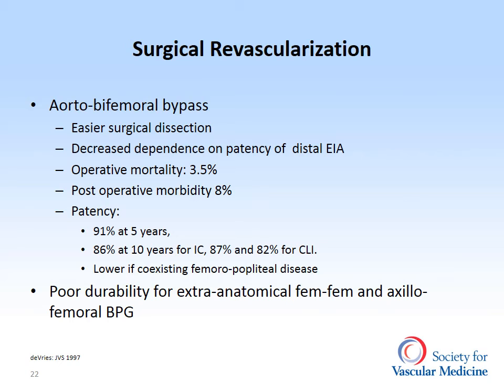Aortobifem bypass remains a very durable surgical option. Its primary disadvantage is the associated mortality and morbidity. With improved durability of endovascular iliac therapies, aortobifem bypass is reserved for most complex aortoiliac disease not amenable to percutaneous intervention.